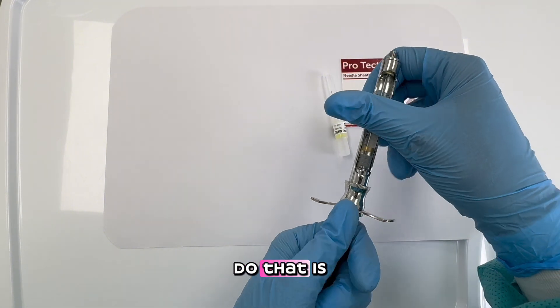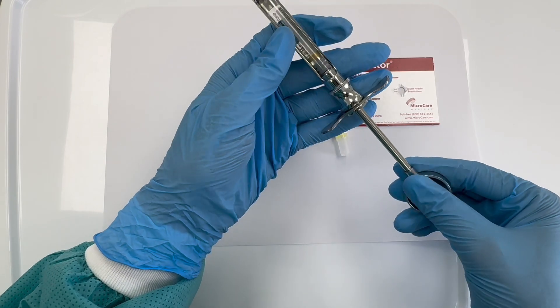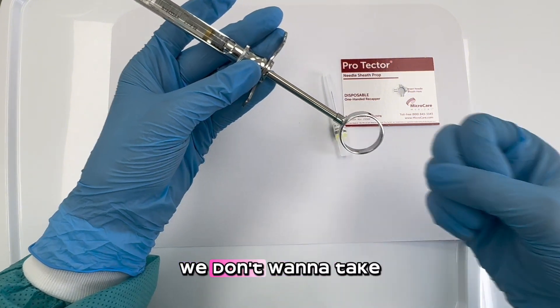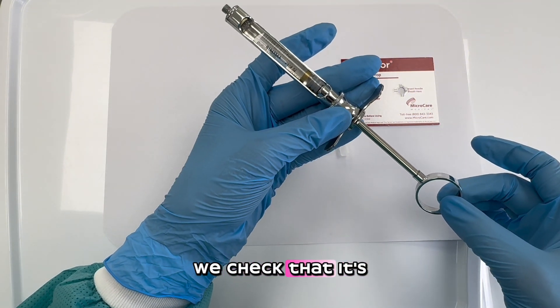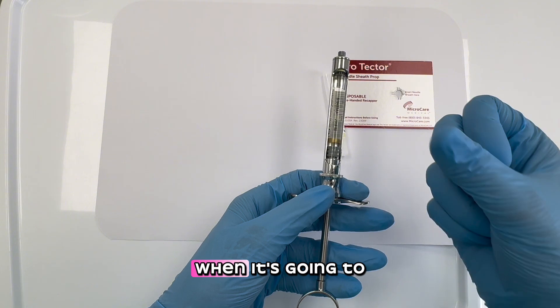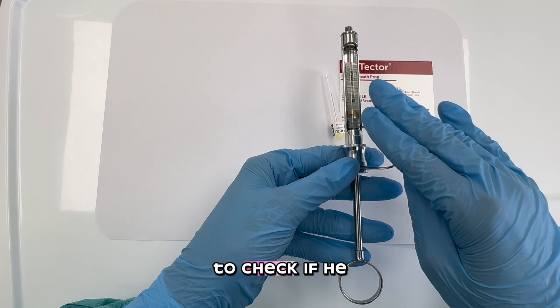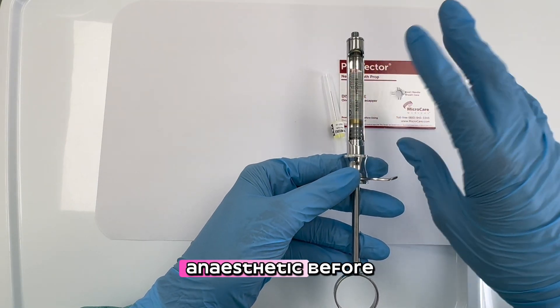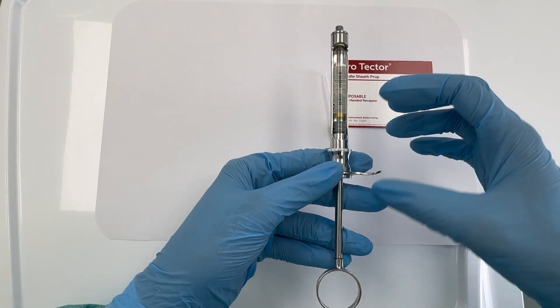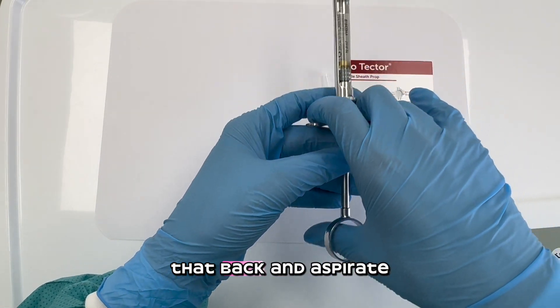Once we release the harpoon, we need to engage it into the rubber area of the carpial. We hold it and engage it, then check slightly to confirm it's in there — we don't want to pull it out. This is a very important step because the doctor, when anesthetizing, is going to aspirate to check that the needle is not inside a blood vessel. That's why it's critical that the harpoon is engaged so the doctor can pull back and aspirate.